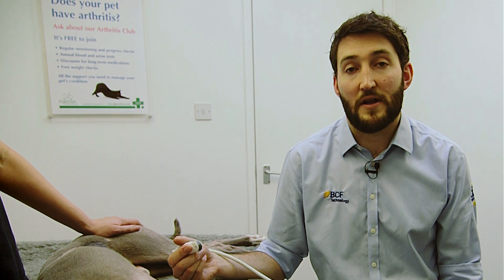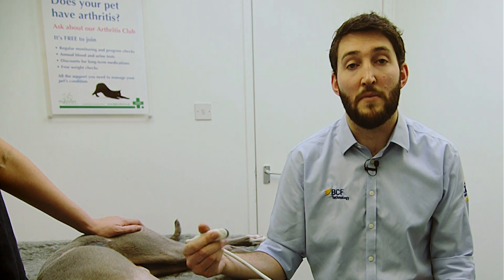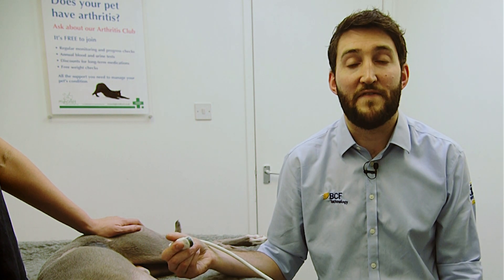In this video we're going to look at imaging the jejunal or cranial mesenteric lymph nodes. These are the other set of lymph nodes that are readily visible in most dogs with a little bit of practice and some good ultrasound equipment. Other lymph nodes in the body are variably present and often, if not reactive, can be impossible to see due to their small size and similar echogenicity to the surrounding tissues.